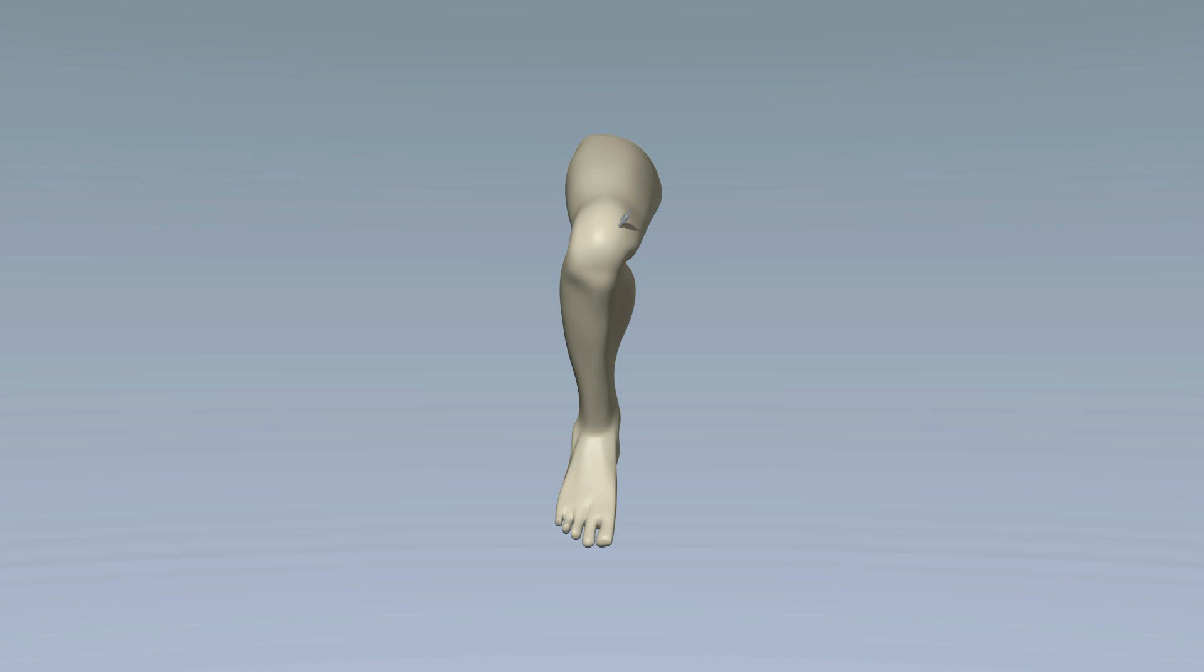It helps to inflate the joint to help the surgical team see more of the joint. It provides pressure within the joint which helps to control bleeding. If there is too much bleeding it becomes impossible to see. It also helps to irrigate and wash out the knee.